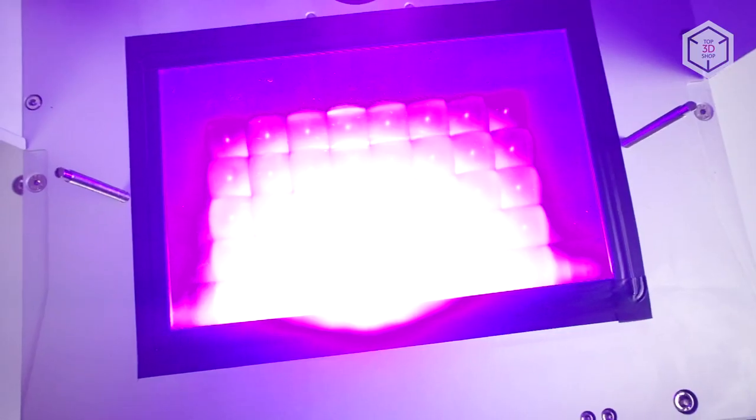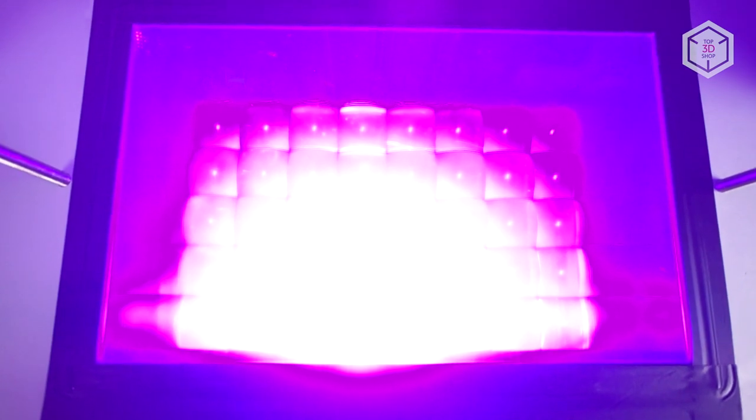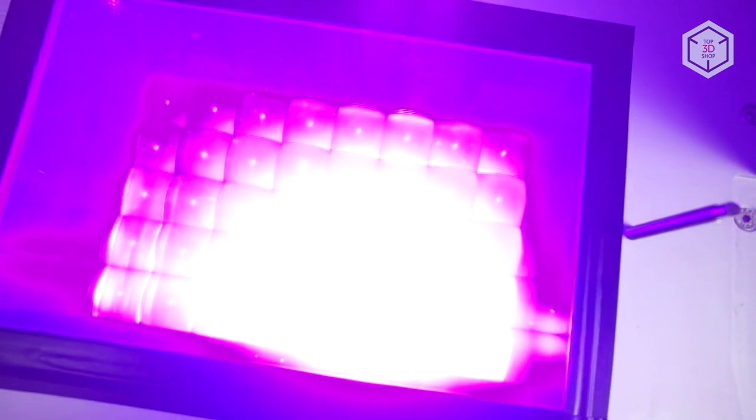In addition, the lighting module has been updated, with the XL 4K 2022 carrying a Para-LED 3.0 LV module. According to Phrozen, it is slightly more powerful than the previous version.